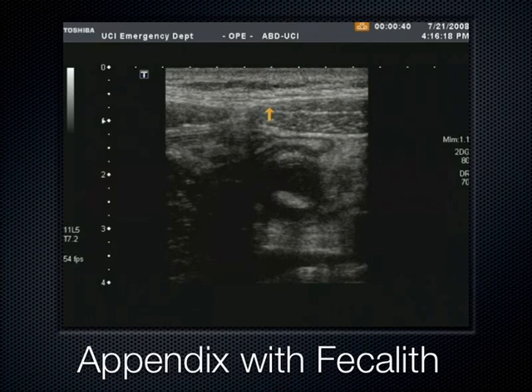That does frighten me, but compressing an appendix, I don't think there's enough extrinsic pressure that you could perforate it. I think really the true perforation comes from the inside getting ready to make it pop. Because yeah, we're pushing a lot of pressure, and maybe I oversold that too much. We're not pushing so hard that we're causing a very local part of it to perforate. I mean, we're pushing enough just to kind of get the muscle bellies to come together.